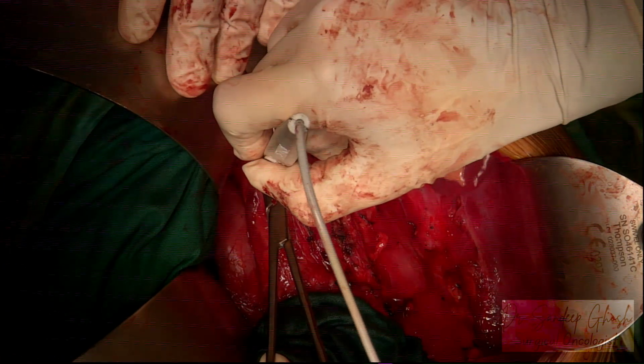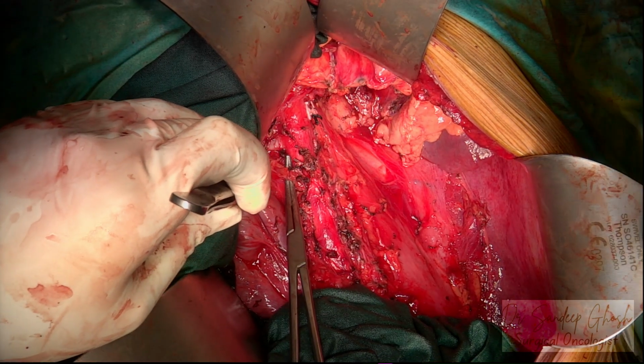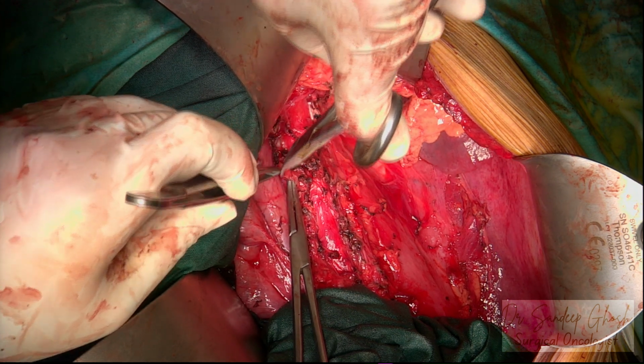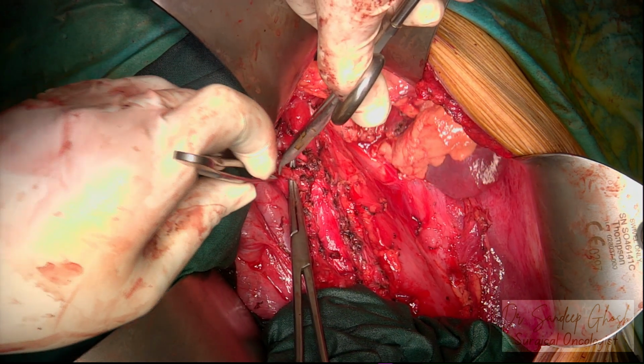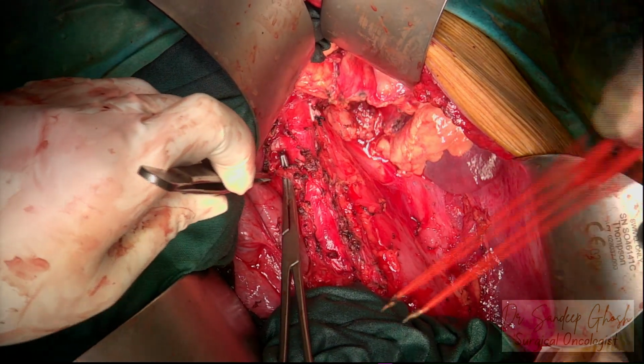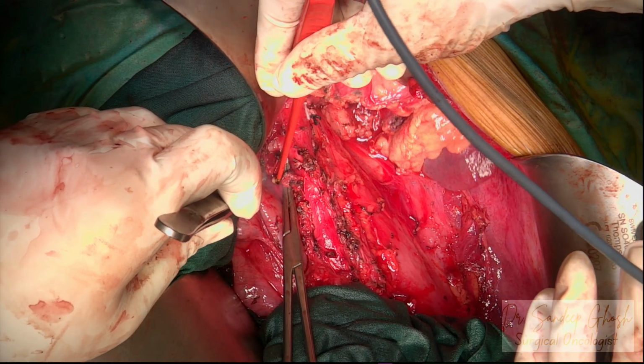Now we are doing the split and roll over the IVC, which has been completed here. Now we are rolling the vessel laterally, and we are doing the interaortocaval dissection.